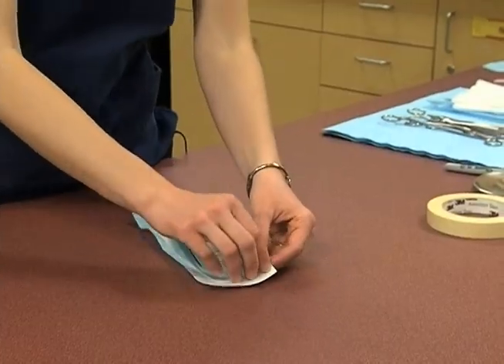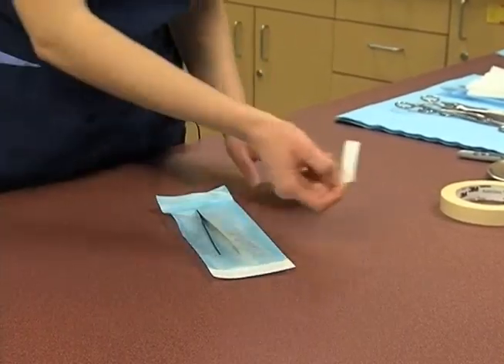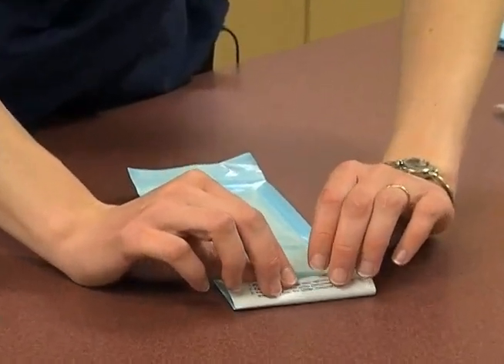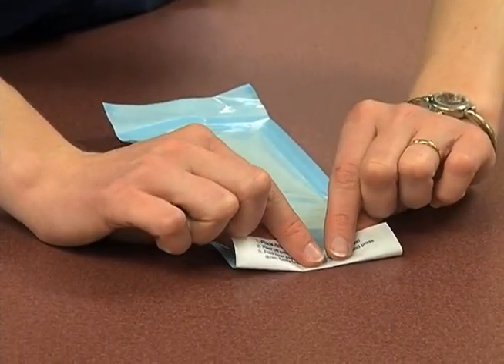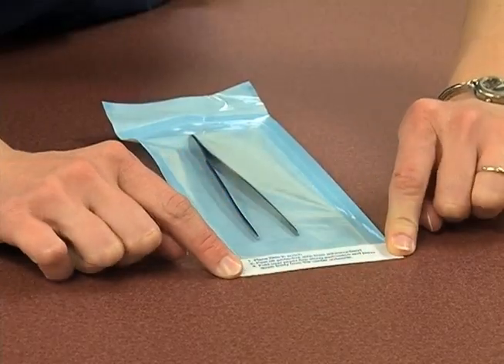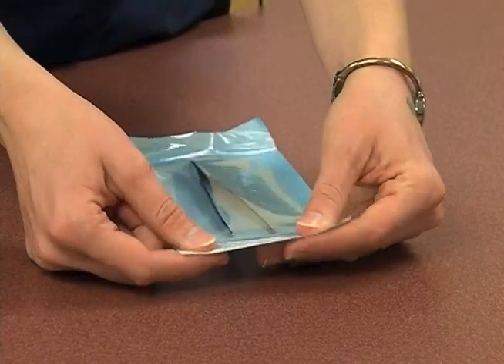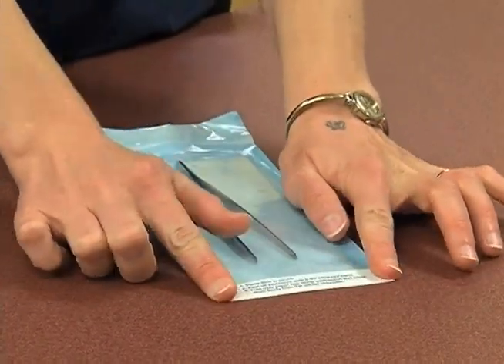The next thing we're going to do is just pull off that cover on the tape and then fold it over. One of the things with these pouches is that they must be folded exactly on this line — that means that it's been properly sealed.